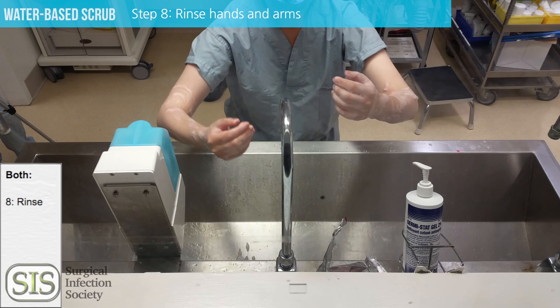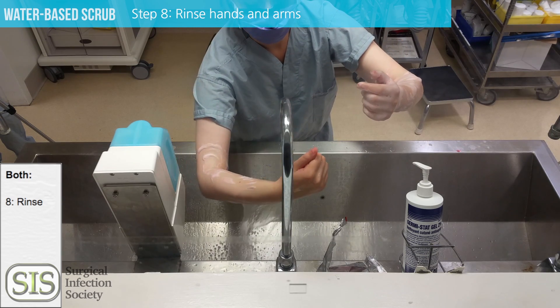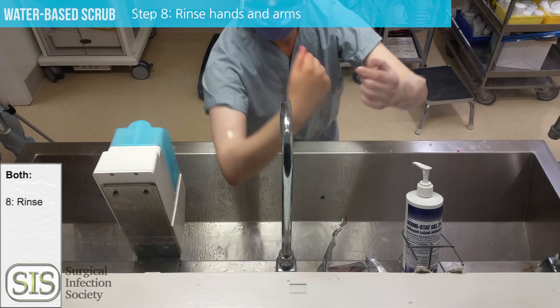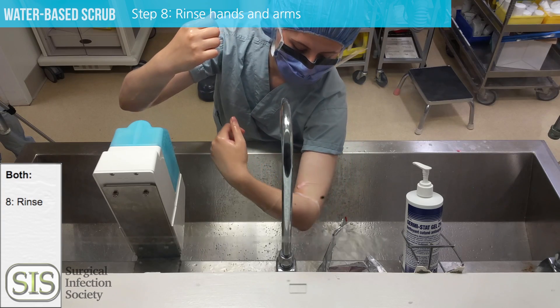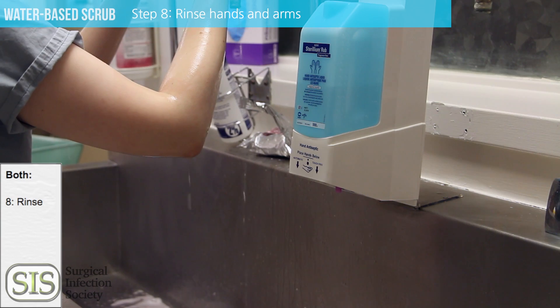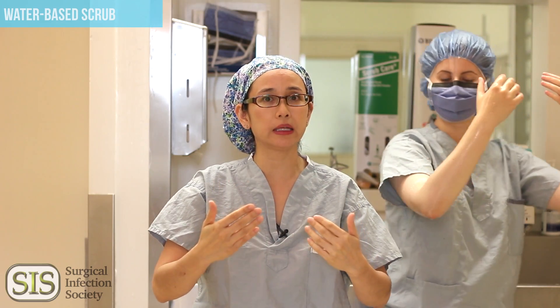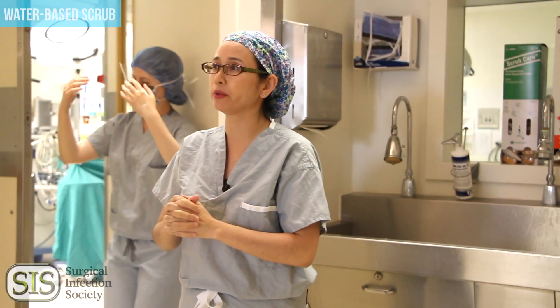Start to rinse. Keep your arms tilted upwards — it's important to be in that upright position, tilted forward. We don't want any water to drip from a non-sterile area into the hands you've just cleaned. Dripping is okay. Back away from the sink, go towards the door, and a sterile towel will be awaiting for you in the operating room by your scrub nurse.